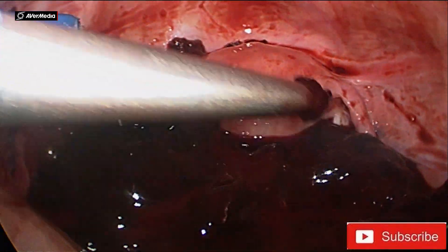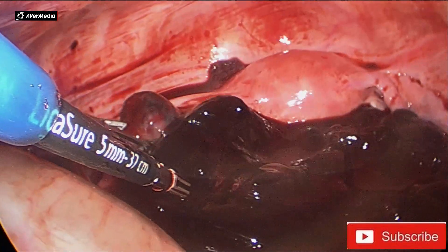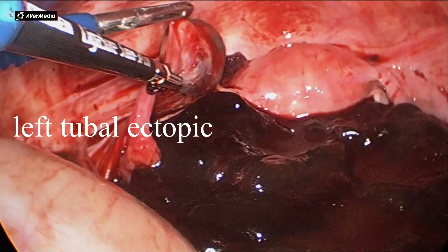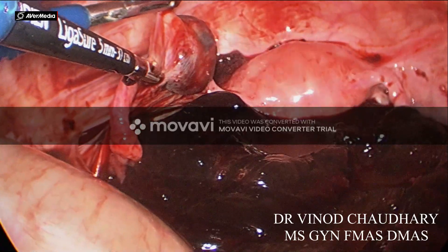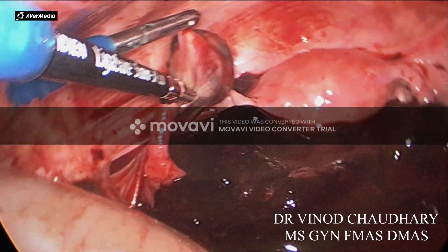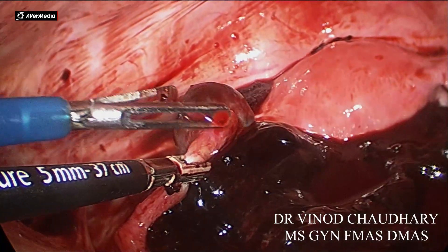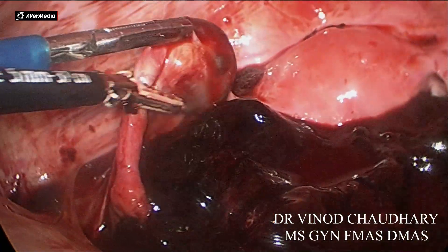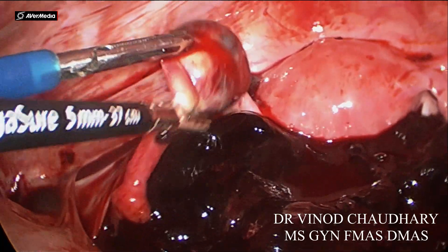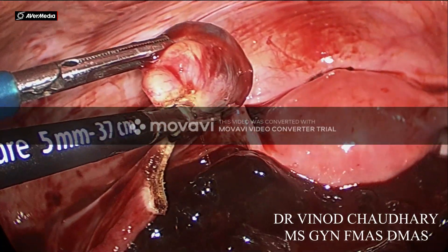Now you can see the ectopic part. Usually ectopics do not bleed this much, but this rupture occurred at the anti-mesenteric border. This kind of ectopic bleeds so much — the patient can even die from this condition if it is not properly managed. Here we are removing the ectopic part using a LigaSure.